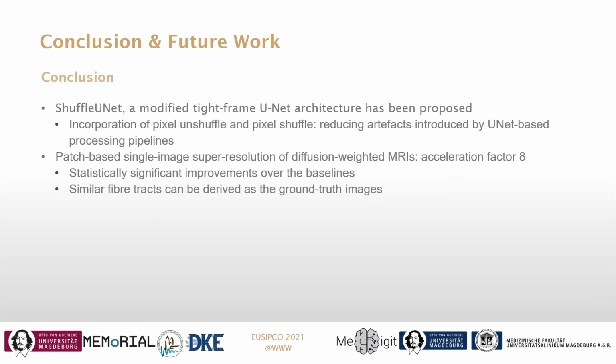The network managed to achieve statistically significant improvements over the UNet model as well as the different interpolation techniques. By comparing the derived data, we can conclude that the fiber tracts can be derived from the super resolved images similar to the ground truth images.